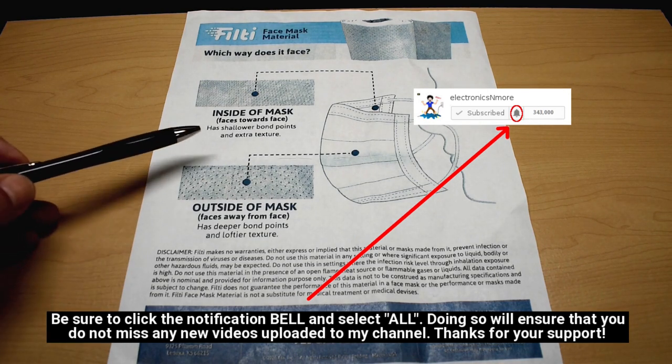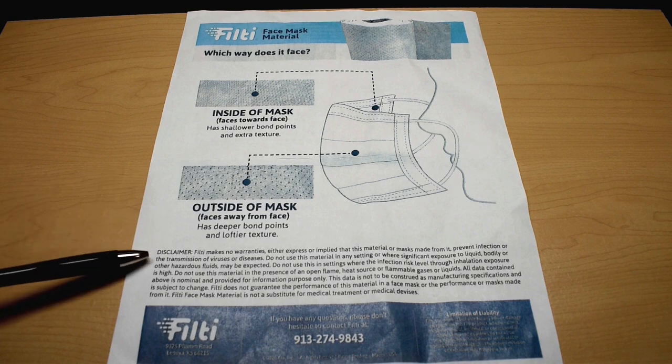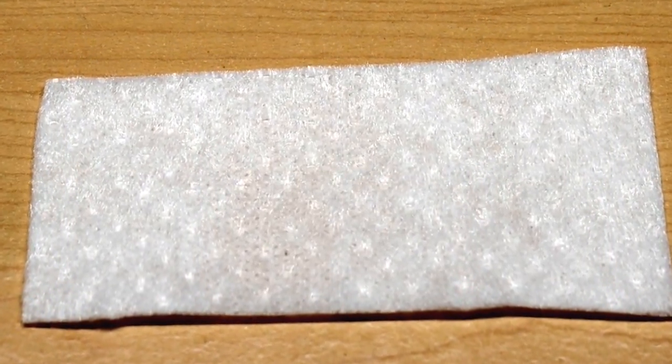Because this is patent pending, there are no FDA approvals for this, so of course there is a disclaimer. Right here is a look at that material up close. Let's zoom in and you can see each one of those bond points. Now let's take a look at the opposite side, where you can see the bond points are much shallower.